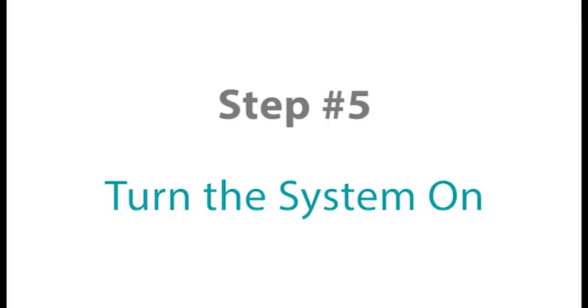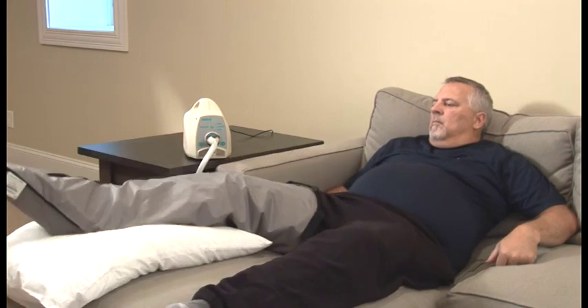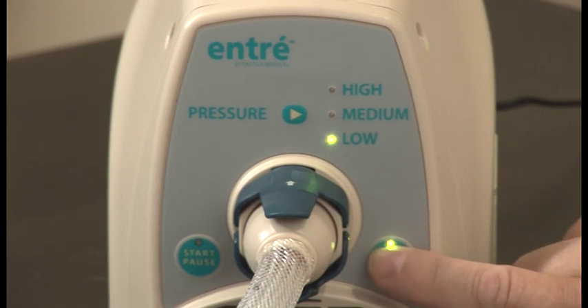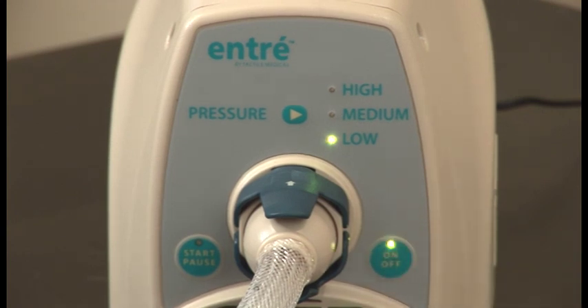Step number five. Turn your ENTRE system on. To turn your controller on, press the on/off button located on the front panel of your control unit. Green lights will illuminate the pressure settings selected and the on/off button on the front panel when the device is turned on.